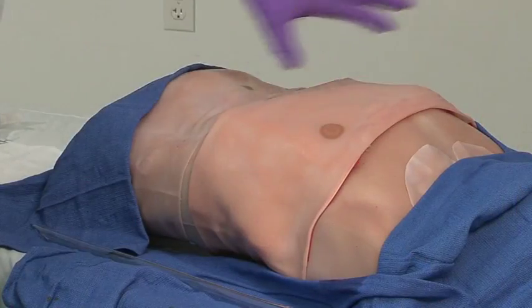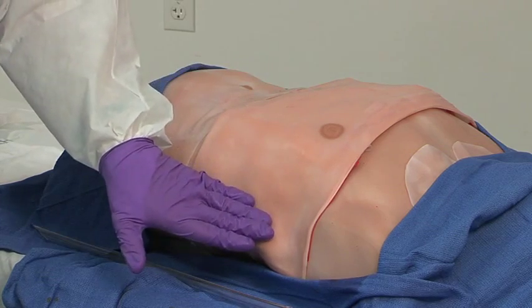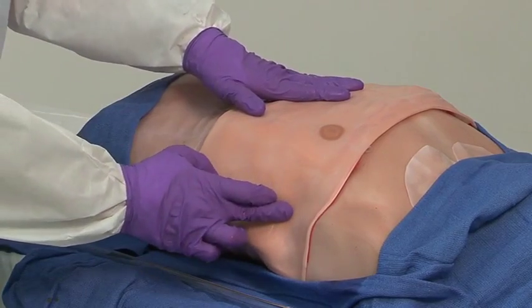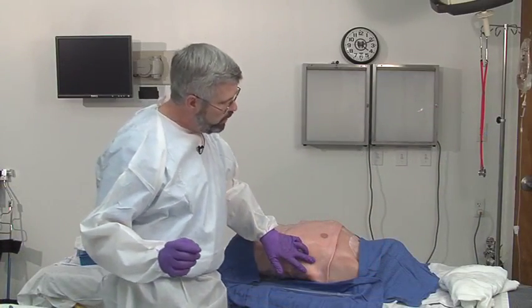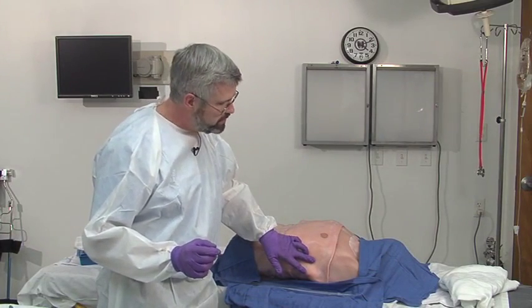Obviously, you want to make sure that you prep this area widely. You're going to once again reconfirm your anatomical landmarks, which are going to be the 4th or 5th intercostal space, approximately right here. If this patient is somewhat aware, it's good to put in some local anesthesia, but we'll assume that this patient is comatose and doesn't need it at this time.